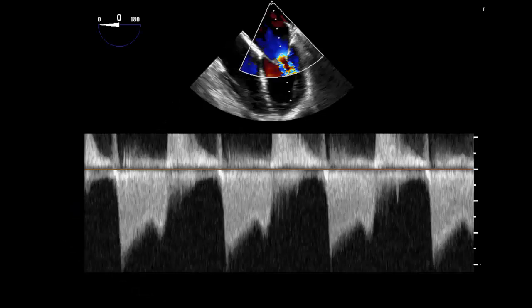Furthermore, we can estimate the mitral valve area by performing pressure half-time, and we can calculate the mean pressure gradient.